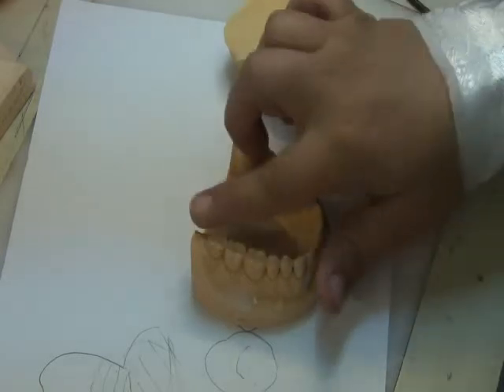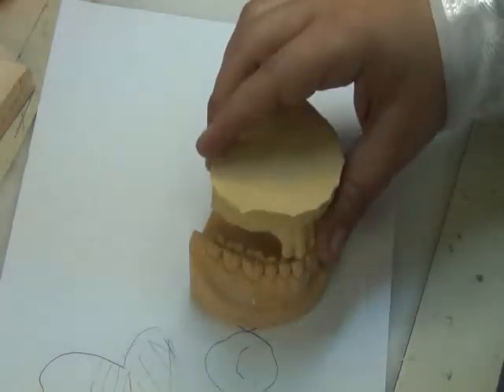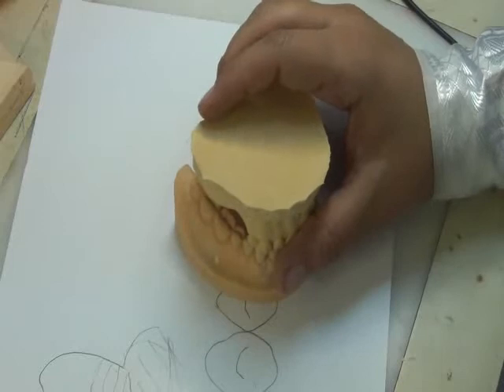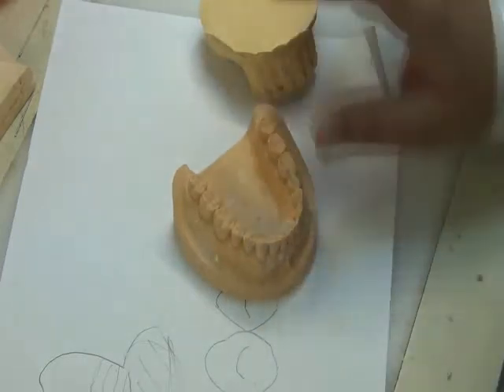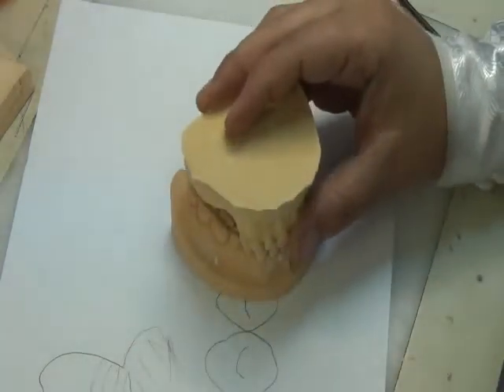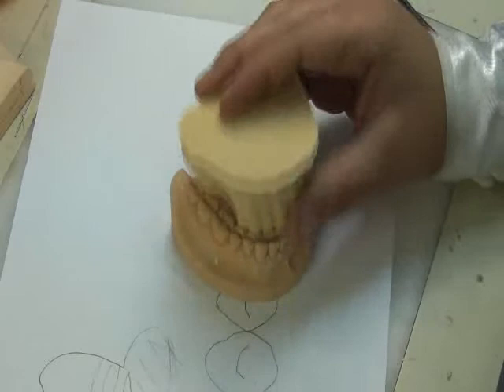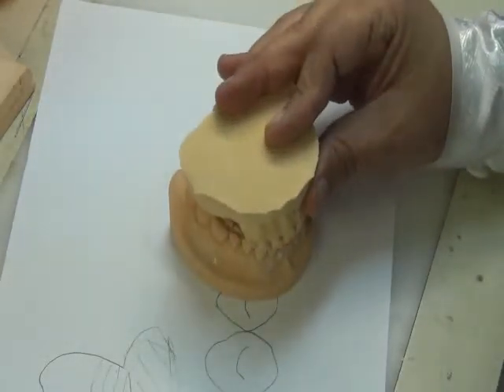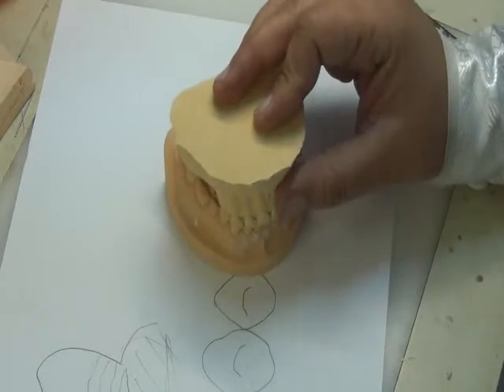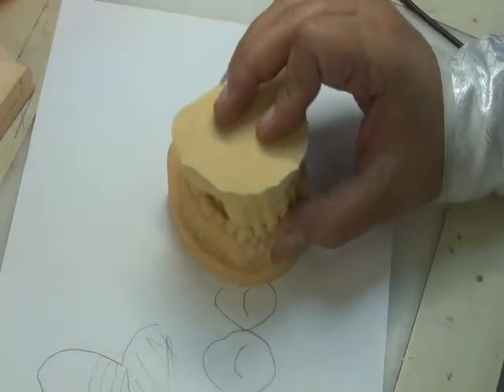But once we have a uniform occlusion and a free-end saddle, we need just to take the bite. And we don't need to go to the RCP because the patient has a stable occlusion and we can register it, and the patient always goes back to this occlusion because the teeth are always telling them to do that. So the teeth will guide the patient, and the periodontal ligament memory will guide the patient always to this bite.